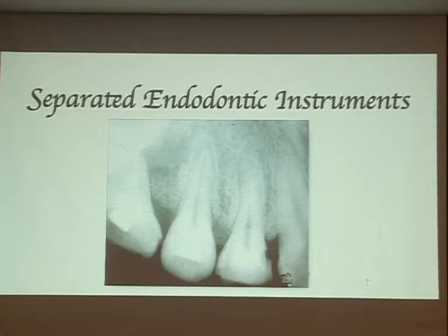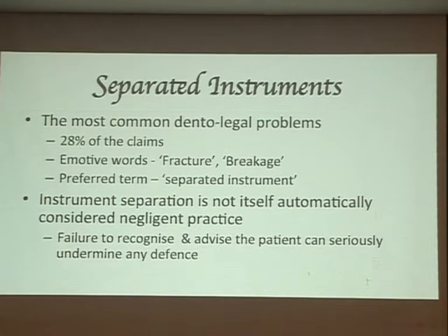Separated instruments. Everyone worries about that, right? There are a lot of reasons people do not use rotary. They say the rotary file will separate. I tell you, all instruments will separate. Okay. If your husband said to you, we will be together forever, he's lying. He only said that to you at that minute. Tomorrow, the day after or a year after, he may change his mind. Nothing in the world is forever.